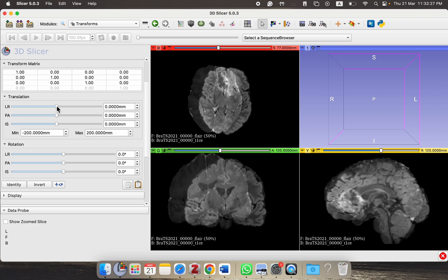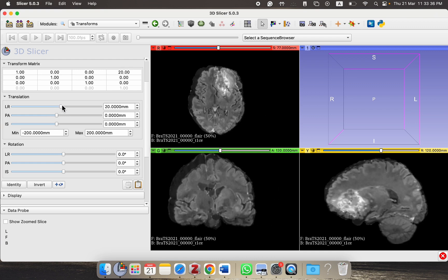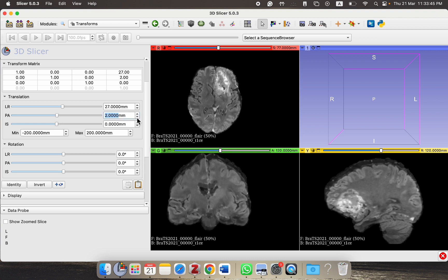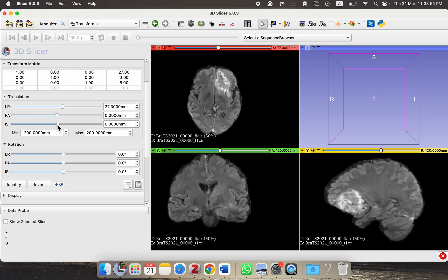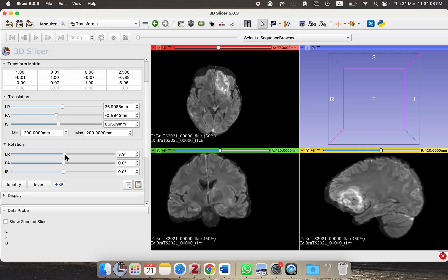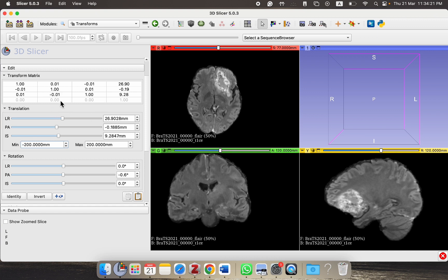These controls allow you to move the object left, right, up, and down, and rotate it using different options to align both modalities on top of one another. As you can see, dragging moves the FLAIR modality on top of the T1CE. There is also an option for correcting rotation if the image is misrotated. The transformation metrics shown here become very handy when coding or pre-processing multiple MRIs — you can take reference of these transform metrics and apply them to your entire dataset.